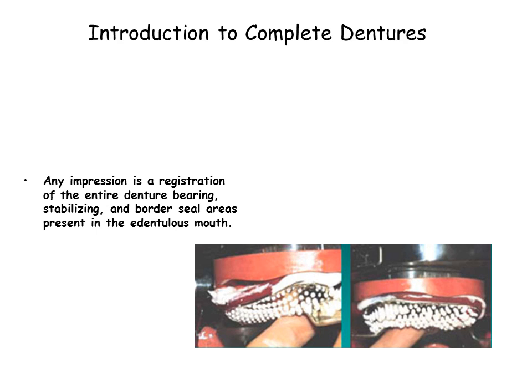Ideally, the patient will leave their existing denture out for 24 hours prior to the impression. Alternatively, tissue conditioners may be placed in the existing denture prior. This assumes much greater importance when making a definitive impression, as opposed to a preliminary impression.